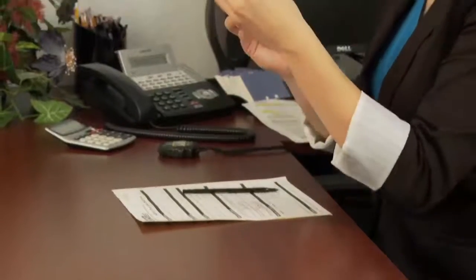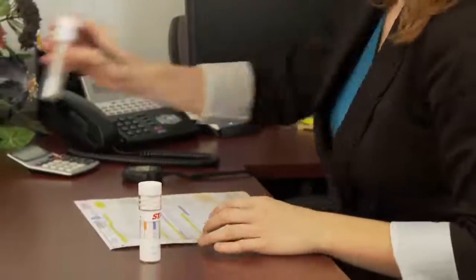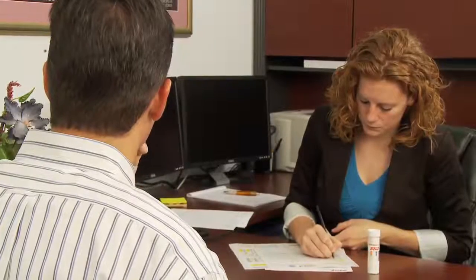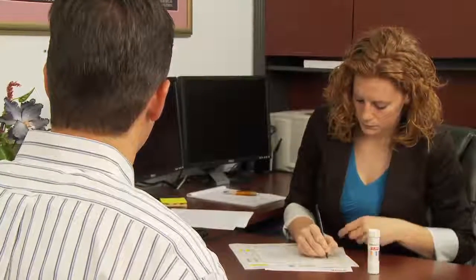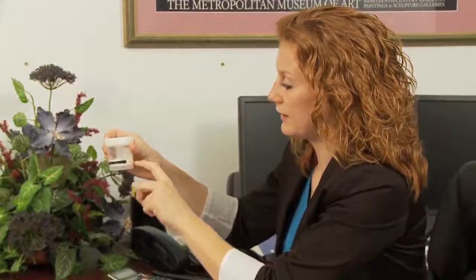If you elect to confirm using the StatSwab device, then a second collection should be taken to ensure that enough oral fluid is available for testing. In this situation, use another StatSwab collector cap, sponge, and collection chamber without test strips to send to the lab. An alternative confirmation test may be conducted with urine. Contact your service provider for further assistance.